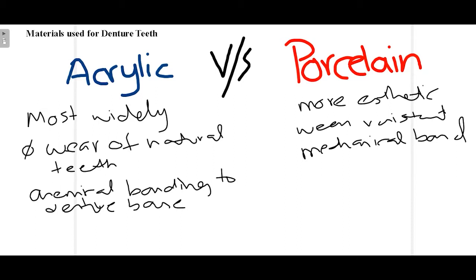Now, talking about disadvantages of acrylic, acrylic wears easily, and because of its wear, the vertical dimension decreases, and it stains and discolors over time as compared to porcelain.